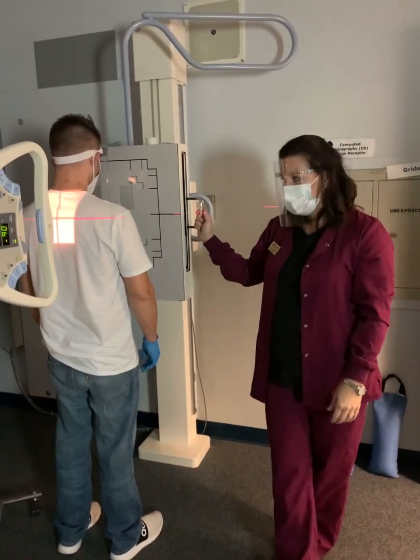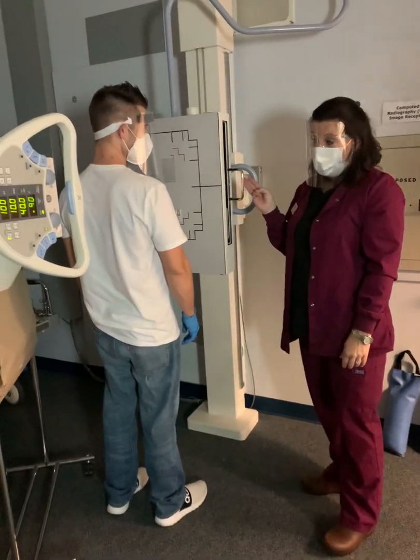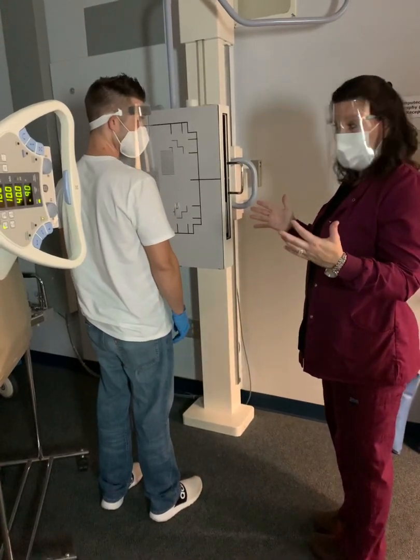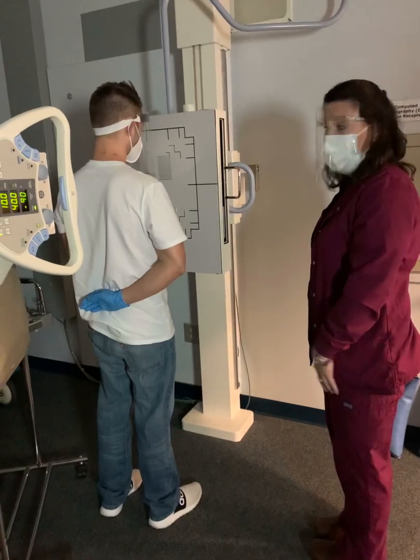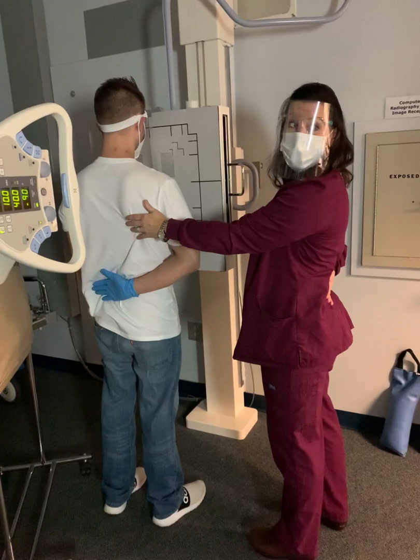of the scapula. Well, three different places really that you can put the arm. Ideally, the best place to put the arm for a lateral scapula is the back of the hand on the back, okay? Look what that does. It really pops that scapula out, allows you to see it very well.